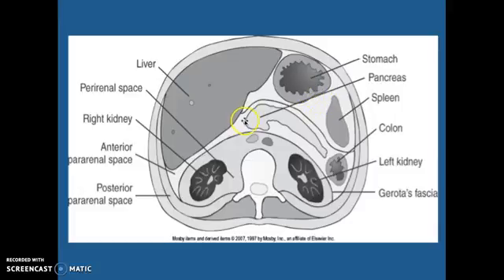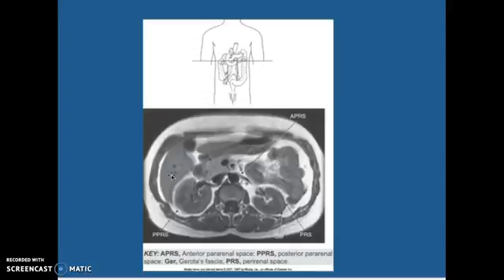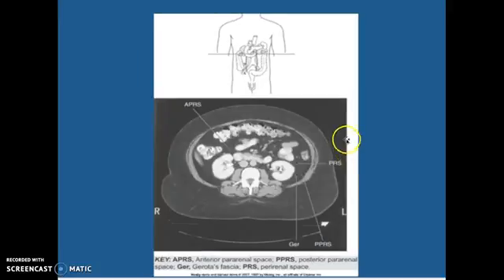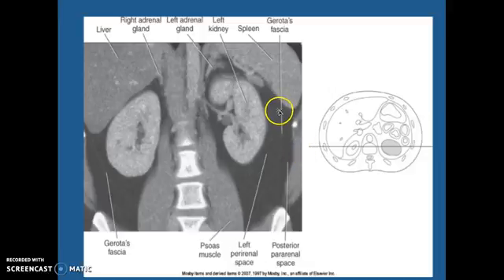Stomach, spleen, colon. Your Gerota's fascia comes around and you can actually see it on some of the images. Left kidney, right kidney, posterior perinephric space. You have your anterior perinephric space and your liver up top. I want you to know what Gerota's fascia is. Anterior perinephric space and you have your posterior perinephric space back here. You can see that line right there — that's the Gerota's fascia — and you can see the faint line on the other side also.